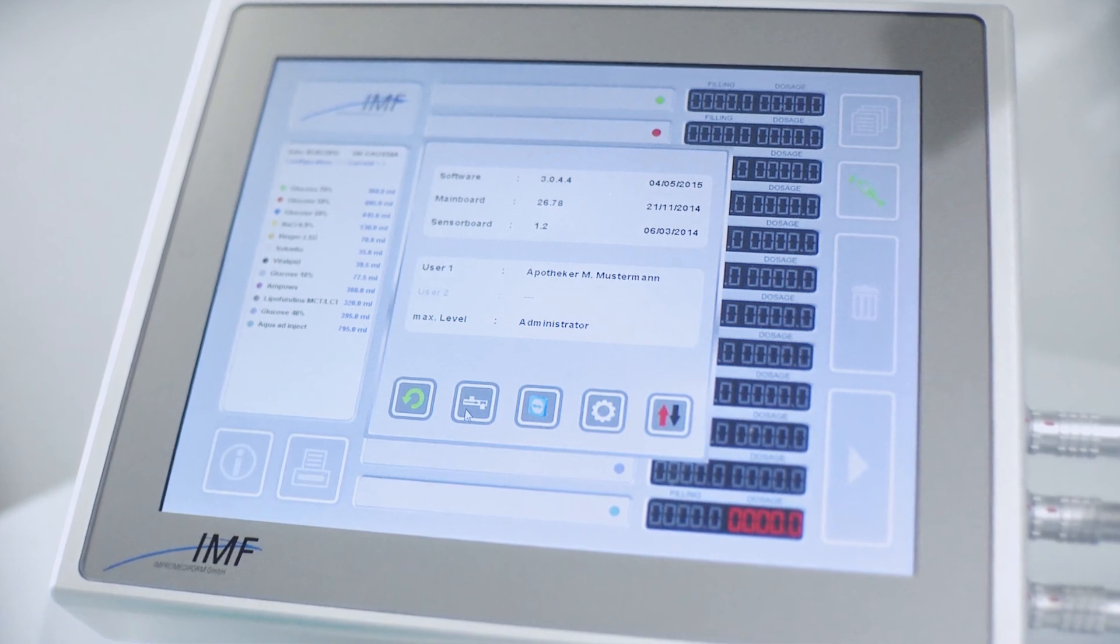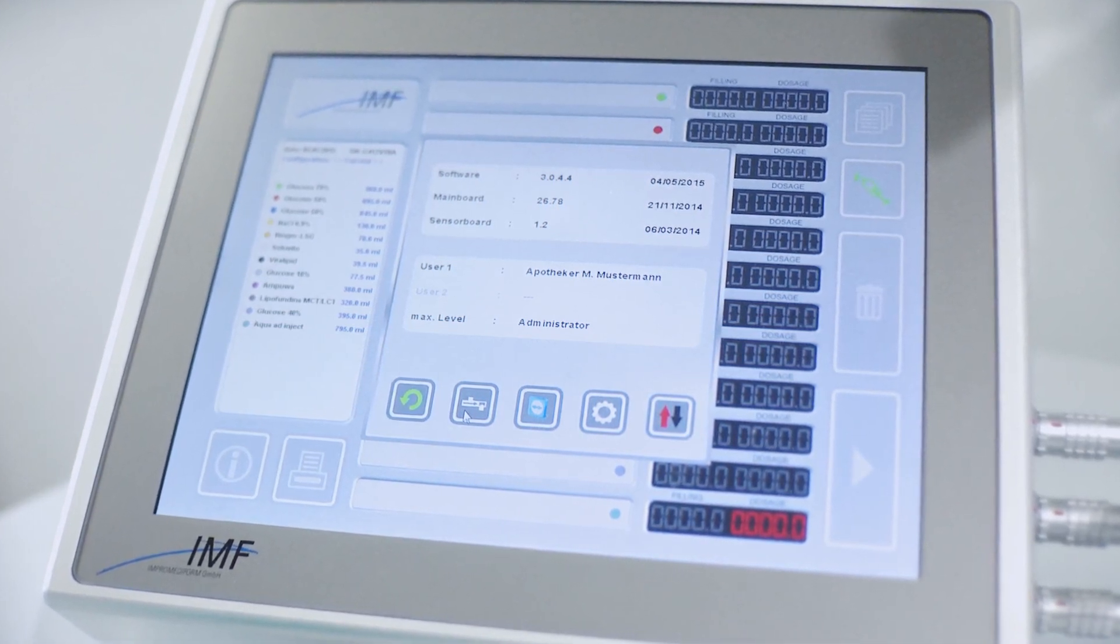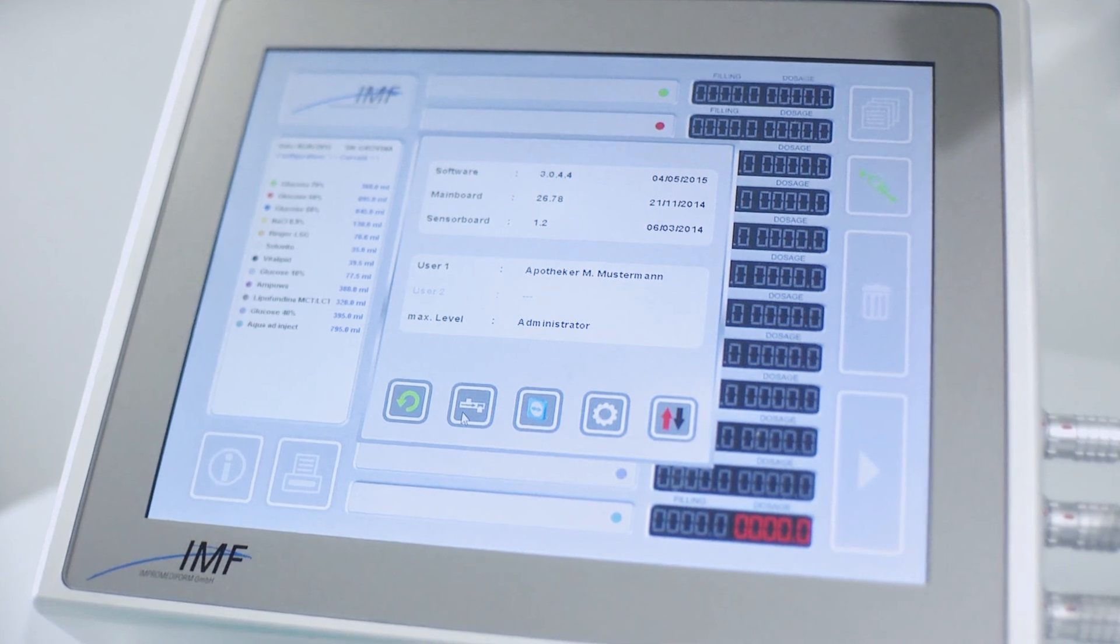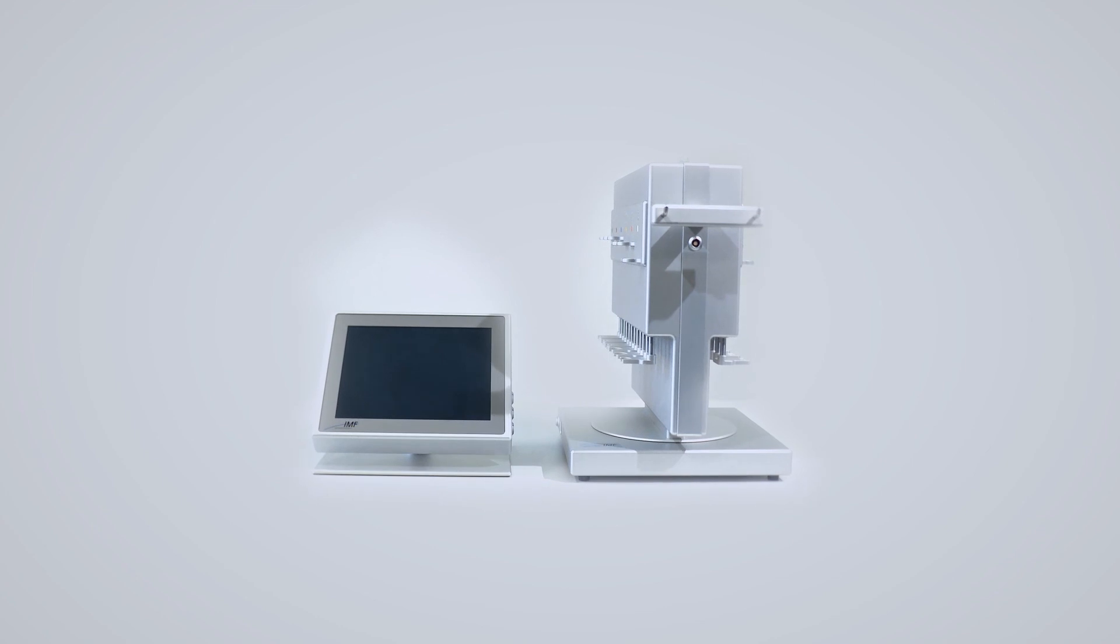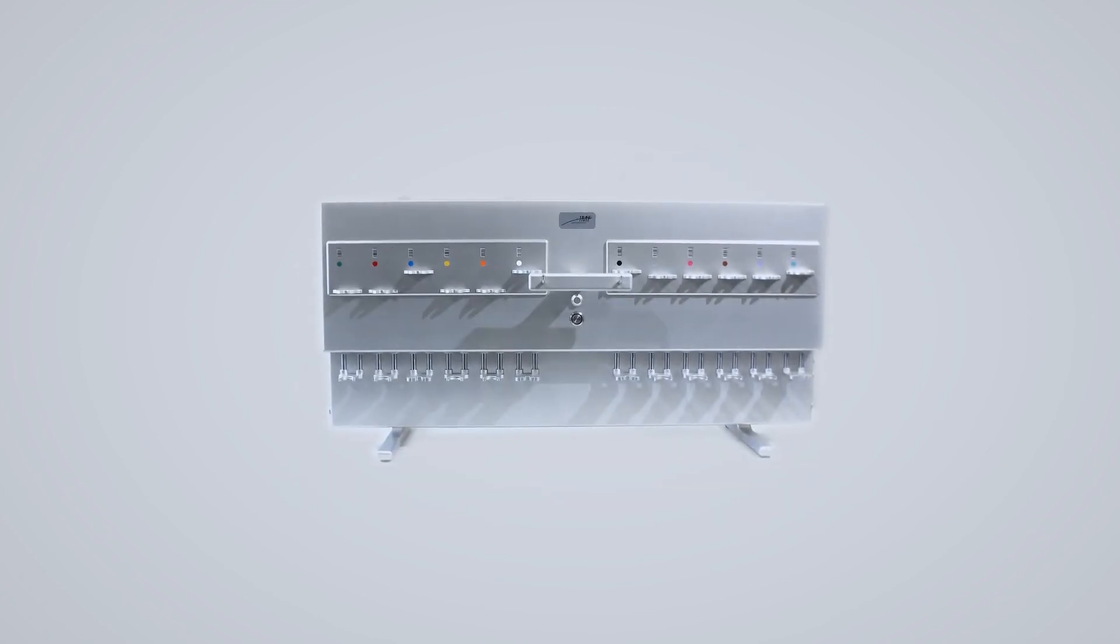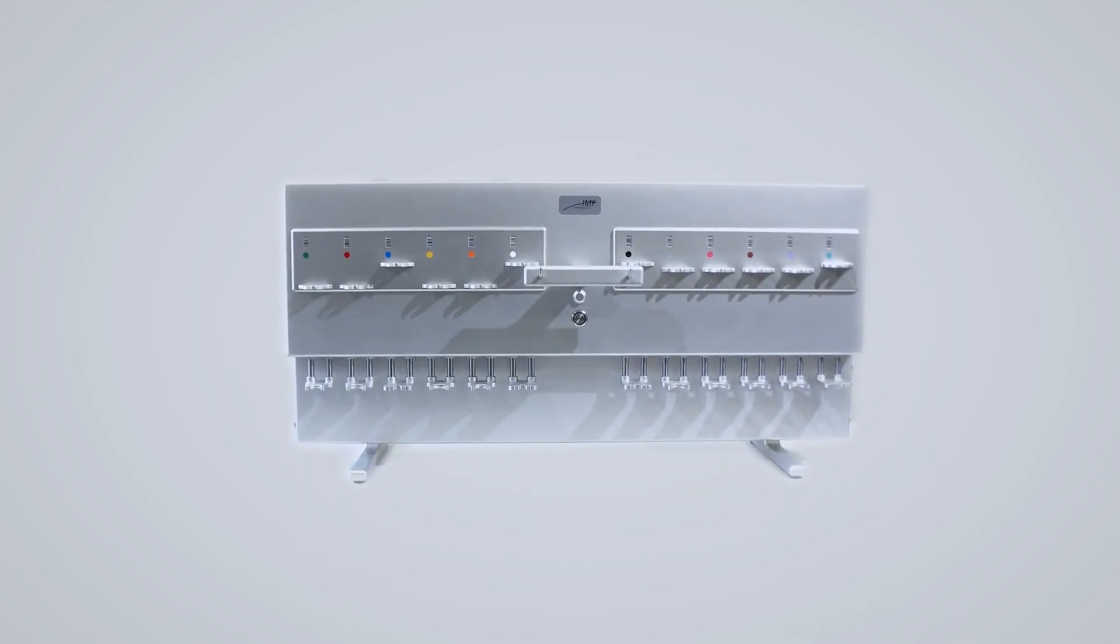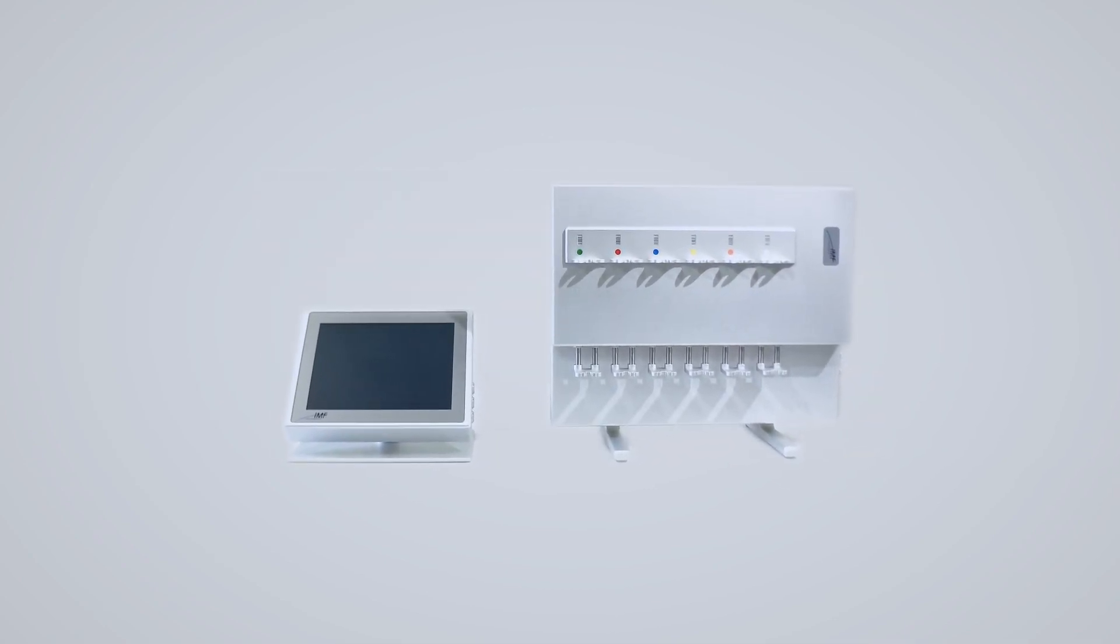ImproMediForm is pleased to offer a huge range of different compounders. Medimix multi-rotatable, 12 channels, ideal for horizontal laminar flow cabinets and small isolators. Medimix multi-standing up, 12 channels, ideal for vertical laminar flow cabinets. Medimix plus, 6 channels, and Medimix mini.